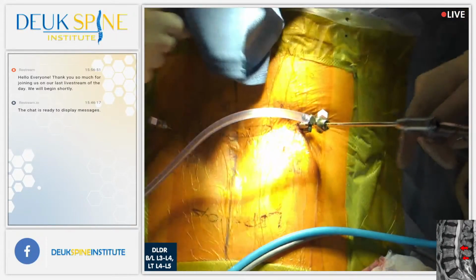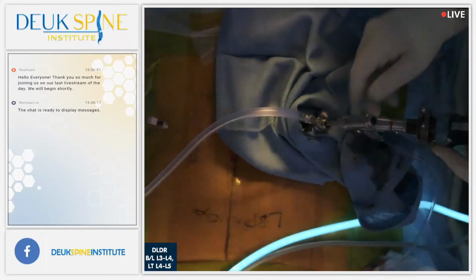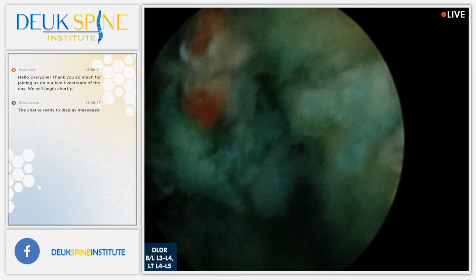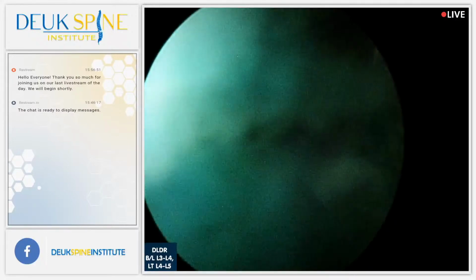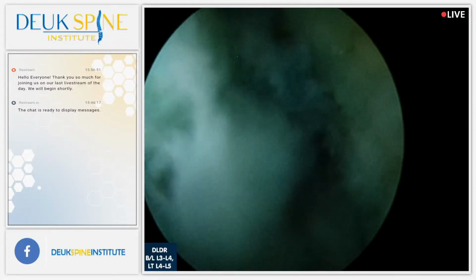I think I've done like 300 cases with you. Never had a patient in the recovery room ever mention recall during accessing the disc, during the hammering, that injury process. They mention it online, that it looks brutal. They all get scared of it. They don't like it. I get it too. I wouldn't like it either.